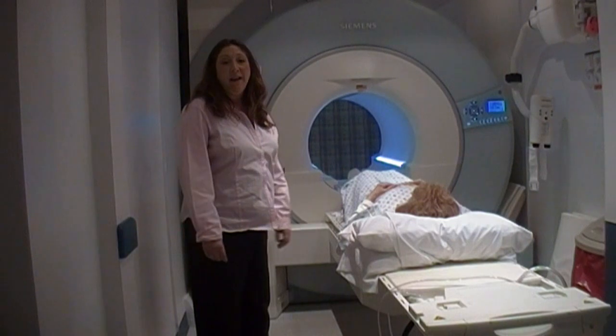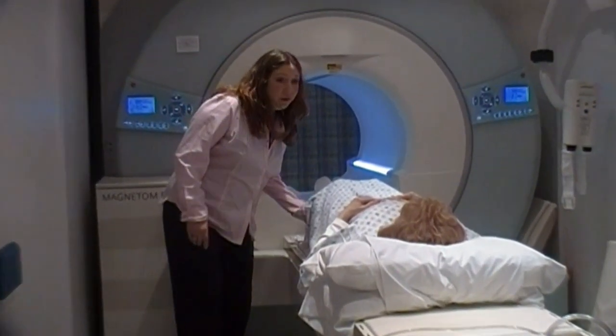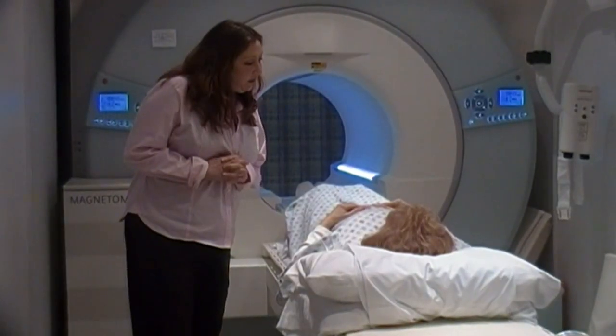Let's show you what it would be like to have an MRI. First of all, we have you lay on the table. We make sure that you're comfortable, putting a cushion under your knees, a pillow under your head. Depending on the exam that you're having, we'll ask what kind of music you want to listen to.